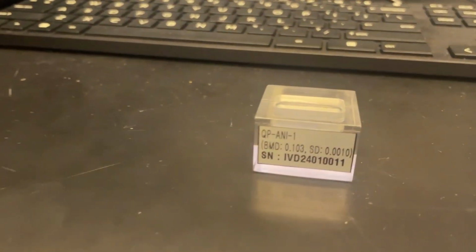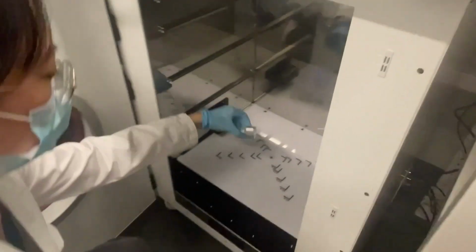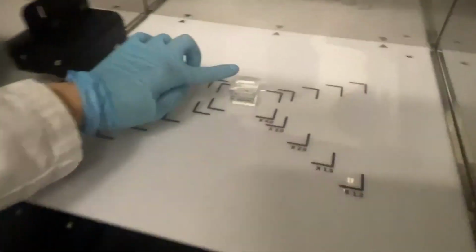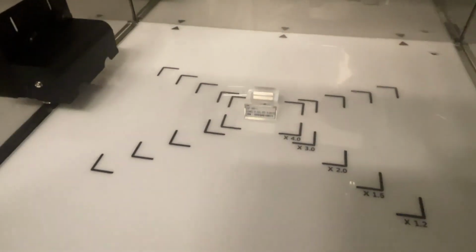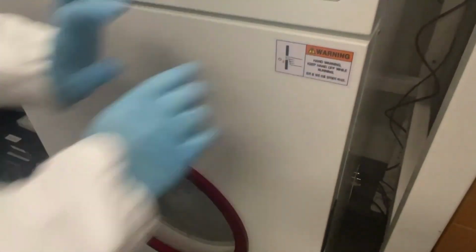To begin with, we need to perform a daily test to check if the scanner is in the right condition. Make sure to power on the scanner and let it warm up for at least 30 minutes before the test. The phantom should be placed in the center of the measuring plate with the label facing towards the door.